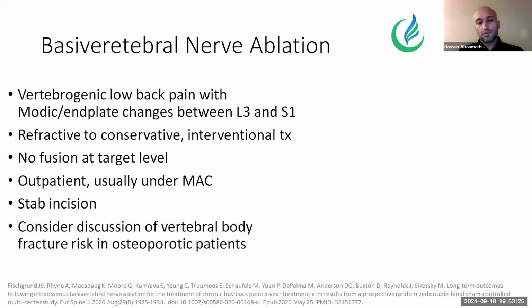And the cool thing about this therapy in particular is that the long-term RCTs have measured these patients. Most of these therapies, they followed patients 2, 3, 4, 5 years out. This one has 5-year data showing that the pain doesn't come back. So compared to some of the other ablation procedures that we do, the nerve, because it doesn't have a myelin sheath, actually does not grow back. So it is a more definitive, more durable, sort of therapy for a pain that in the past was very difficult to treat and we really didn't have a lot of great options for.